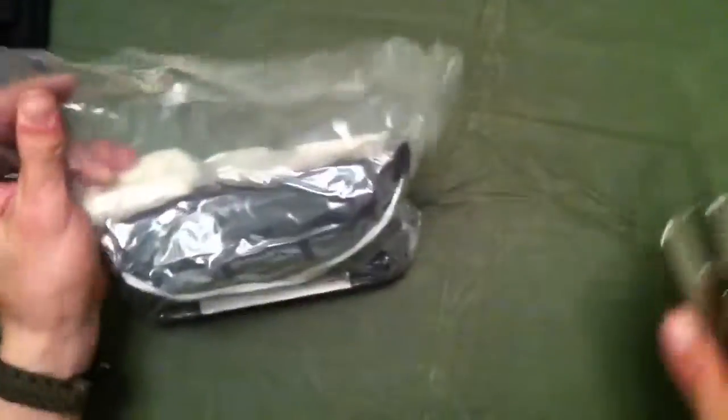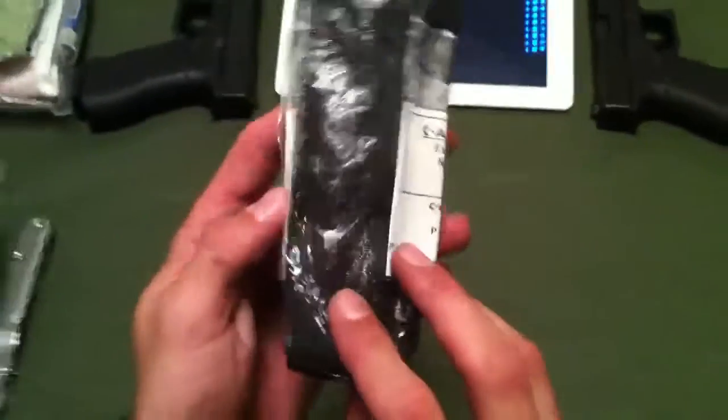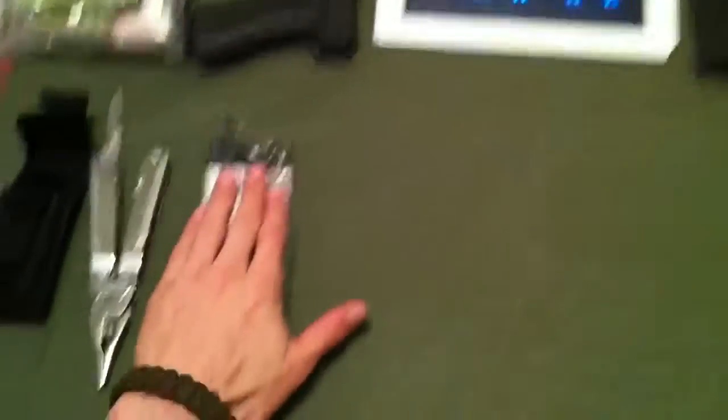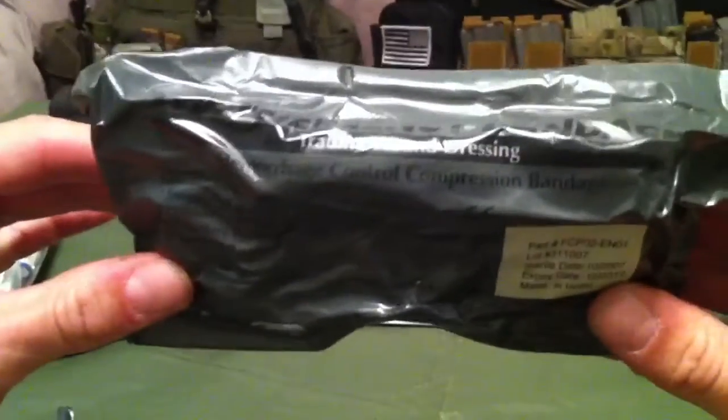We'll go for the big one. If I'm not mistaken, this has got a lot of the life-saving equipment in it. Alright, first off, we have a CAT tourniquet — good to keep one of those handy, always. We have a trauma wound dressing, very good to keep handy too.